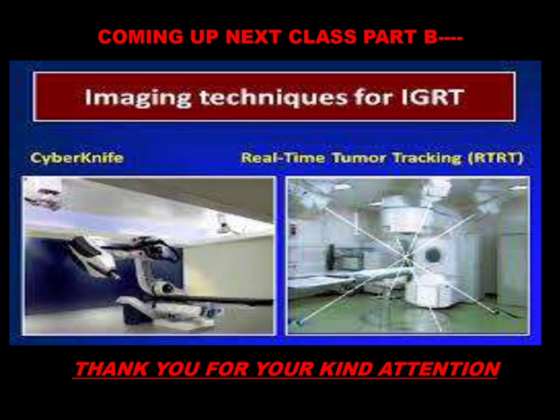There are technologies and solutions for the collection of margins and errors. So what are the margins and errors? An error in radiotherapy delivery is defined as any deviation from the intended treatment plan. A great degree of uncertainty is related to radiotherapy practice, and may be in the form of three types of uncertainties. One is mechanical uncertainties. Mechanical uncertainties are taken care of by the radiation physicist, like treatment unit, gantry angle, couch angle, collimator angle. The brakes are effectively applied, and their movements are effective and accurate.